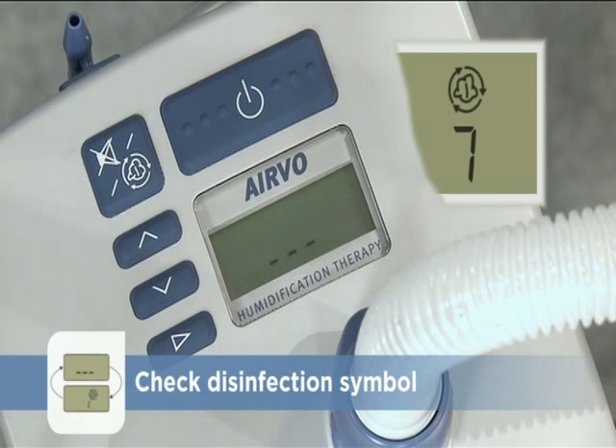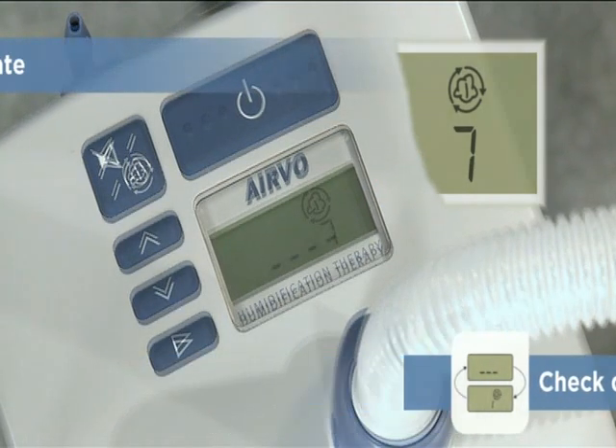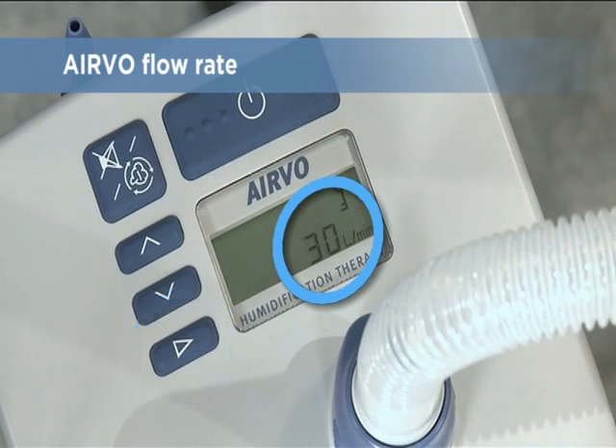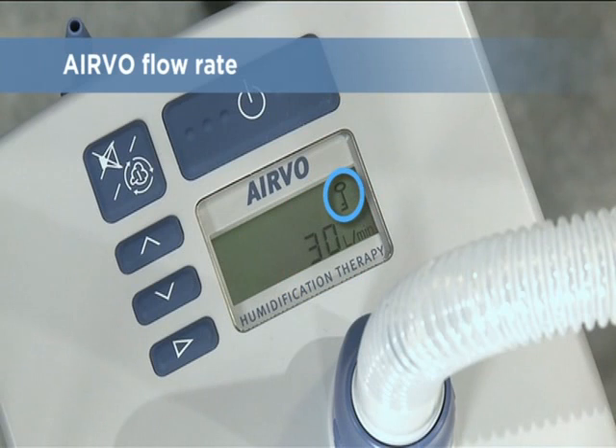This disinfection symbol shows this Evo is safe for use on a new patient. This number displays the total number of times that the unit has been disinfected — you may need to record it in a logbook. Push the mode button at any time to check that the flow rate setting is appropriate for the patient and the oxygen level required. This key symbol means that the flow is locked to prevent accidental changes; refer to the instruction manual or swing tag if you need to change it.